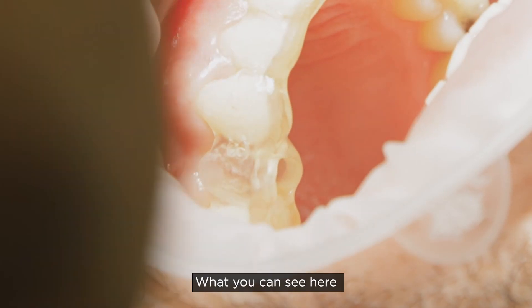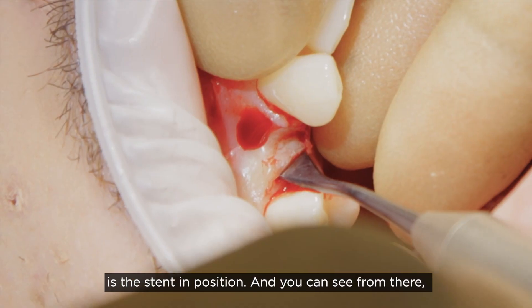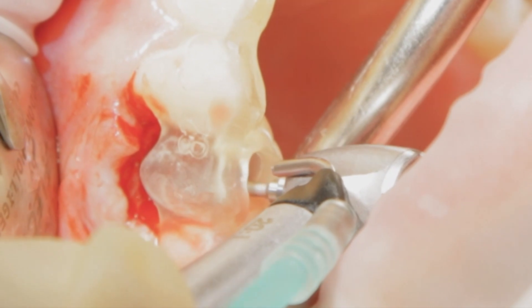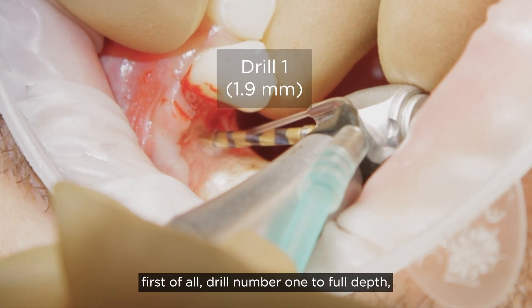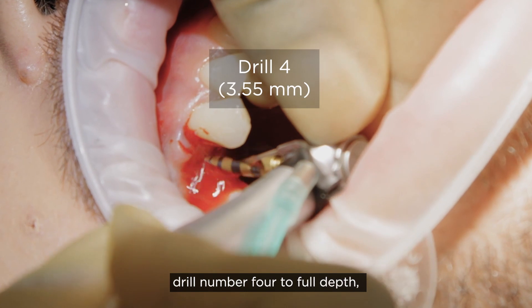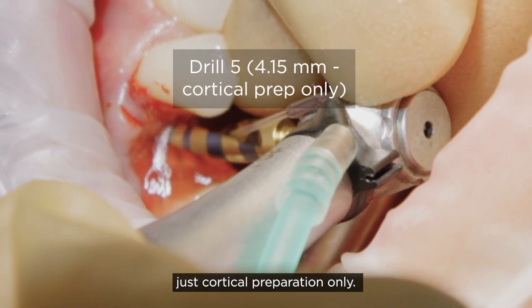You can see the stent in position and from there we're raising a flap. We're using a round drill just to mark the site of the osteotomy. Having marked the site, we use drill number one to full depth, drill number three to full depth, drill number four to full depth, and drill number five for cortical preparation only.